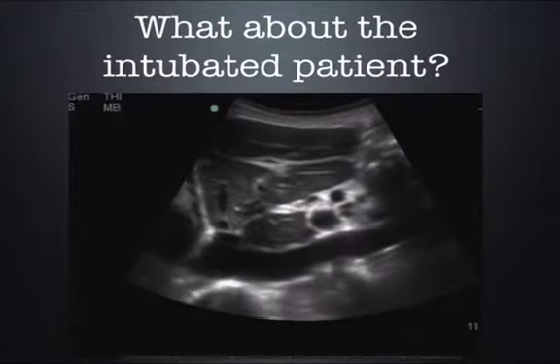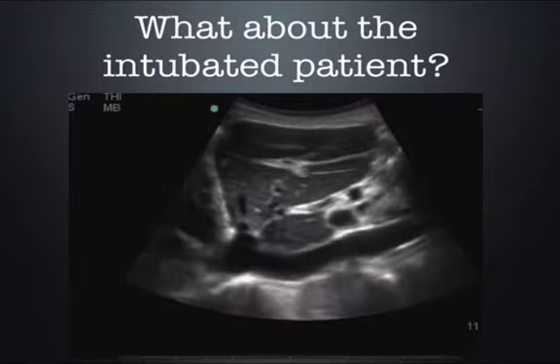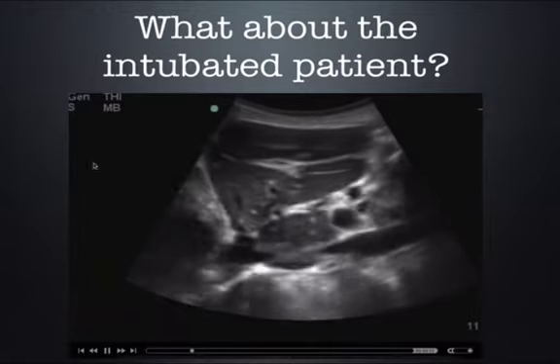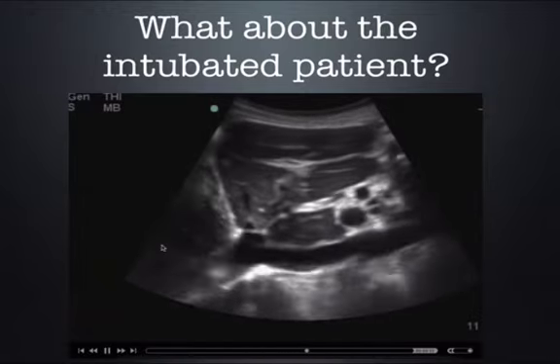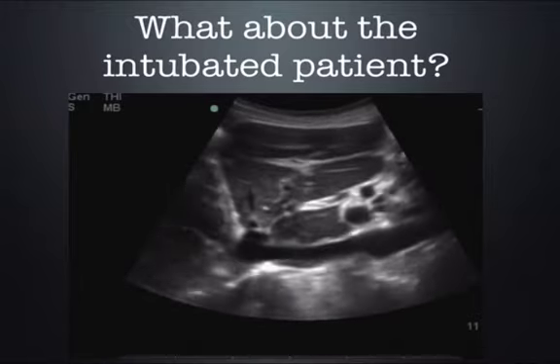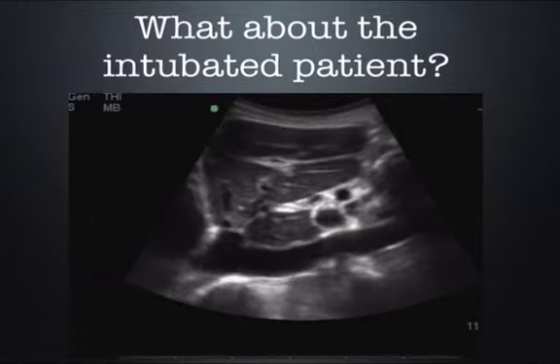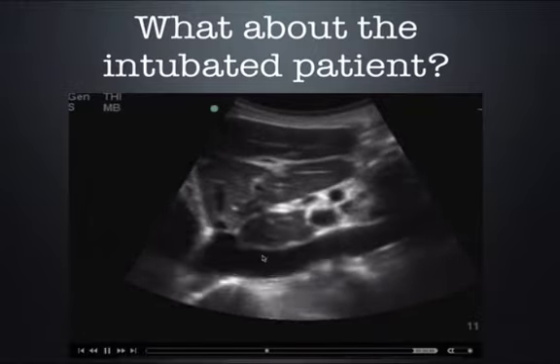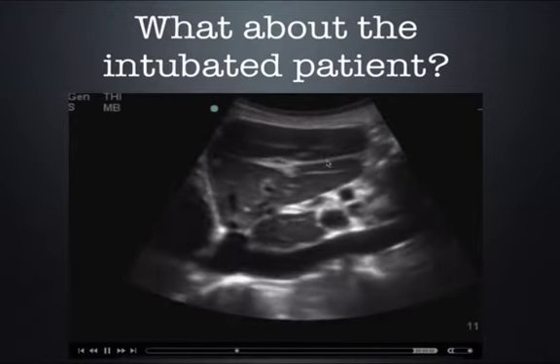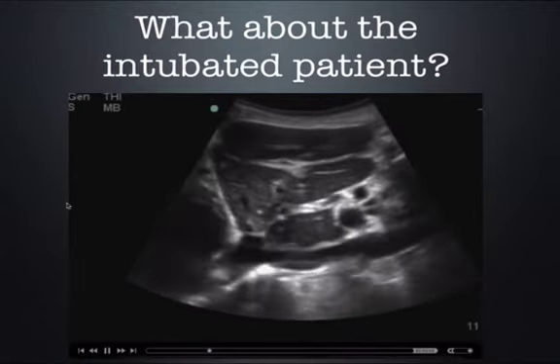So up until this point, we've talked about patients who are spontaneously ventilating. Patients who take their own breath, they generate a negative intrathoracic pressure which pulls air into the lungs. Not only does negative intrathoracic pressure pull air into the lungs, it also sucks blood up into the thorax. Just like if you were drinking water or a Coke through a straw, you generate a negative pressure in the oropharynx which pulls that drink up into your mouth. At exhalation, the IVC is at its largest diameter. Here the patient takes a breath in, the diaphragm and the liver go down towards the feet, narrowing the IVC.